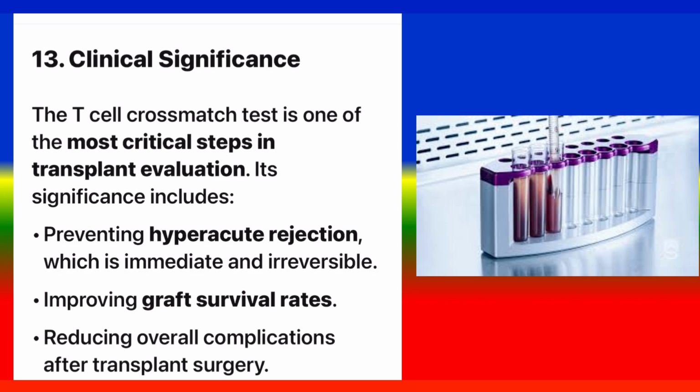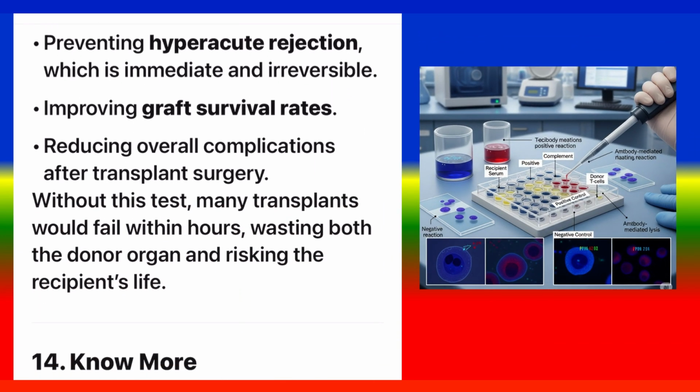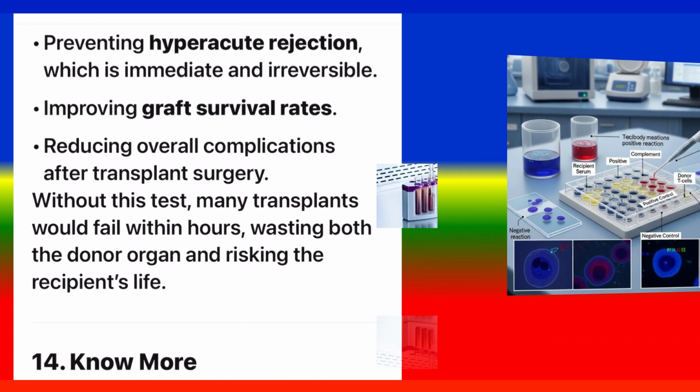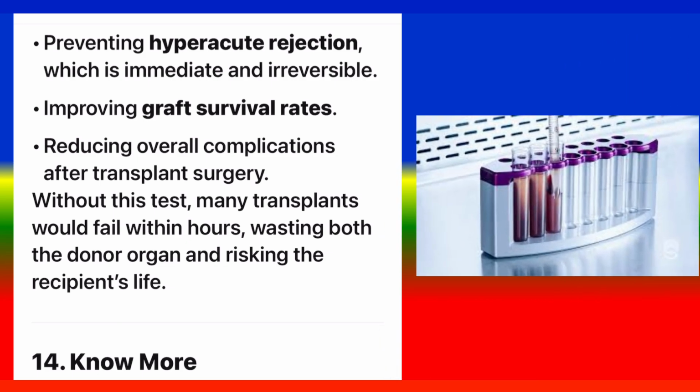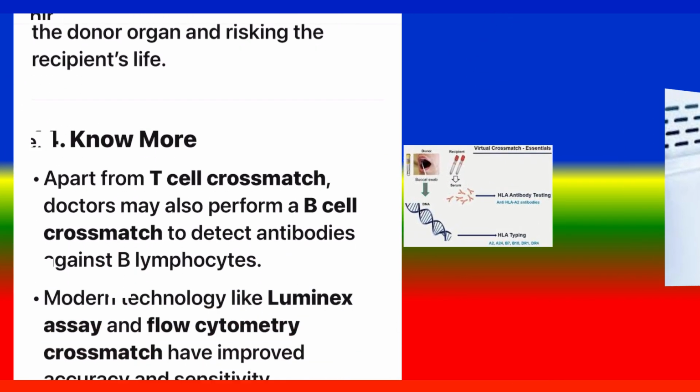13. Clinical significance. The T-cell crossmatch test is one of the most critical steps in transplant evaluation. Its significance includes preventing hyperacute rejection, which is immediate and irreversible, improving graft survival rates, reducing overall complications after transplant surgery. Without this test, many transplants would fail within hours, wasting both the donor organ and risking the recipient's life.